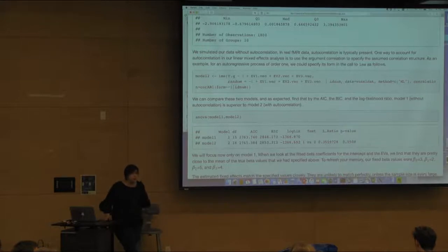Okay. So it's a little bit difficult to take raw fMRI data. We've not come up with a very good method yet of computing the right level of autocorrelation and extracting that from the fMRI data yet. That is a project. It can be done, and so there's no barrier to it, but I actually found that it is easier to account for the autocorrelation sometimes in your model.